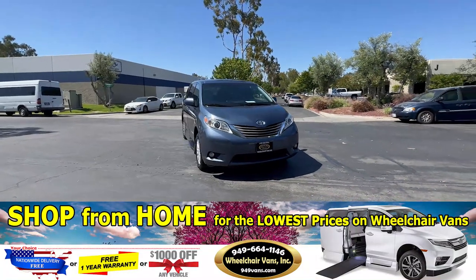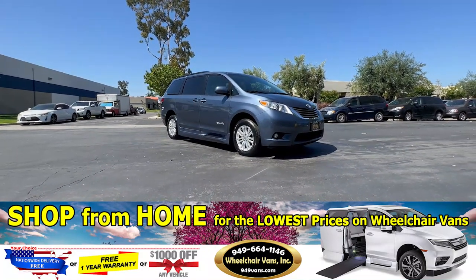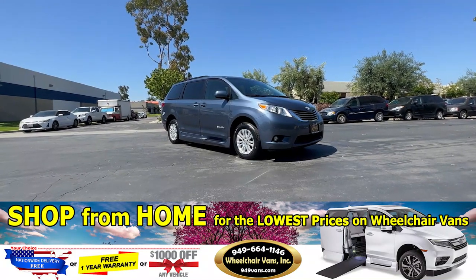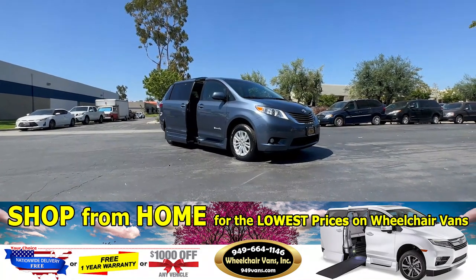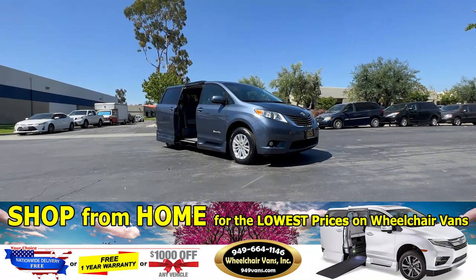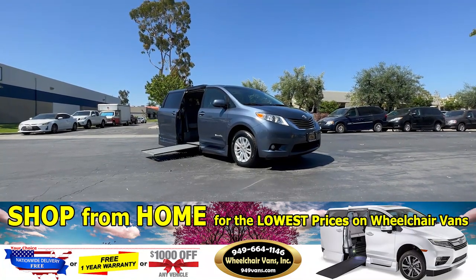Hello and welcome to Wheelchair Vans Inc. Today we will be going over a 2015 Toyota Sienna equipped with the BraunAbility Power Inflow Ramp. To operate the ramp, you will use your key fob to hit the sliding door button here. This is going to open the door, deploy out the ramp, and will also lower the vehicle.